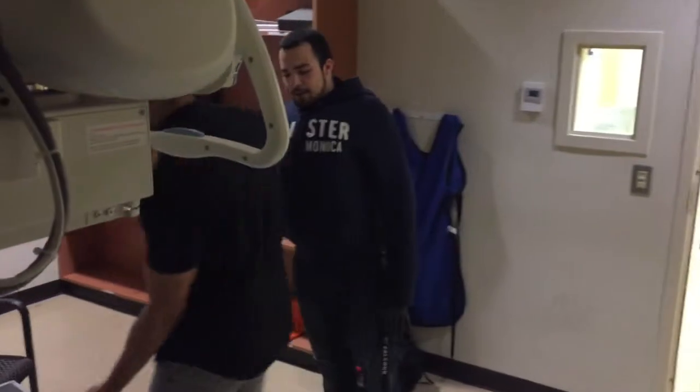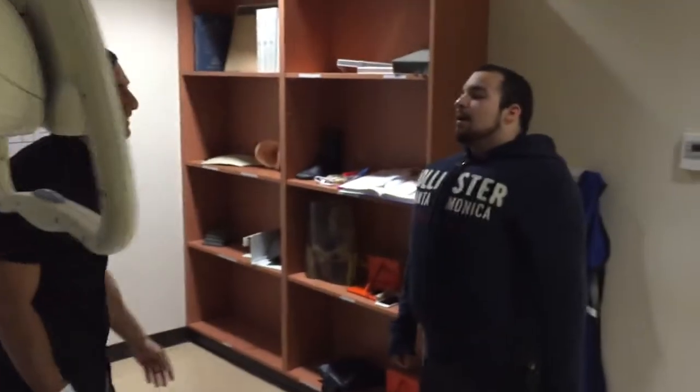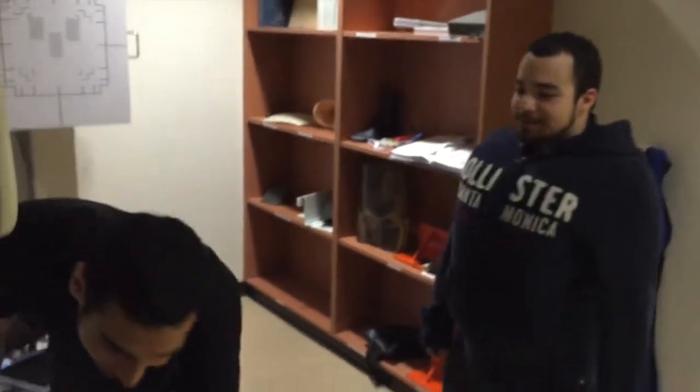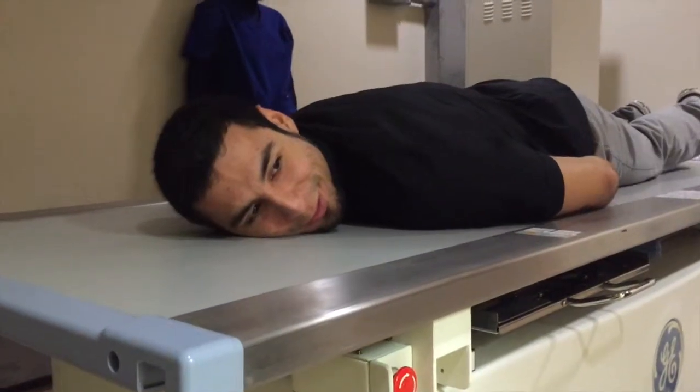Okay. I was actually thinking about joining the program. Do you think you can walk me through what's going on and let me know what you're doing? I guess. Get on the table. Okay. Alright. So, what are you doing first?